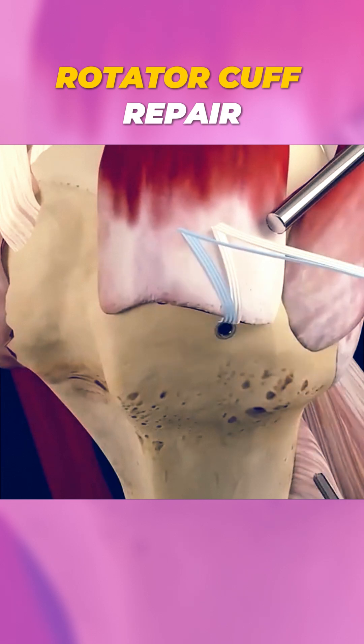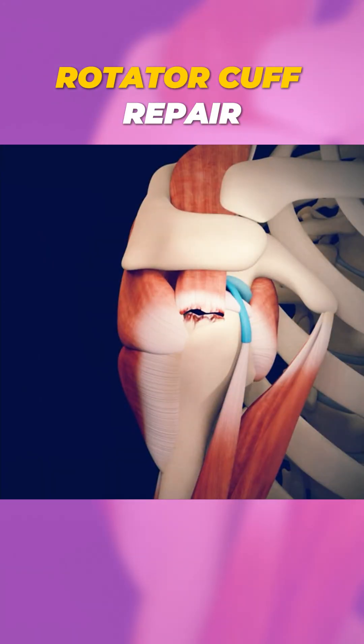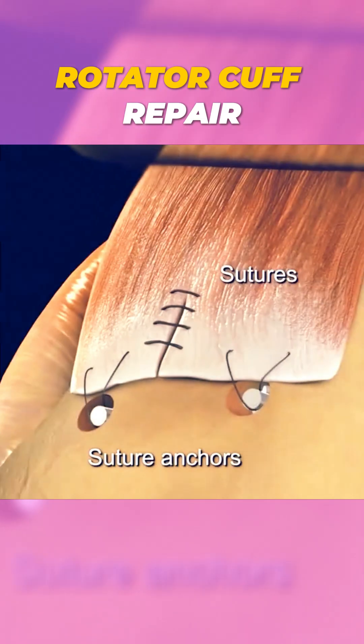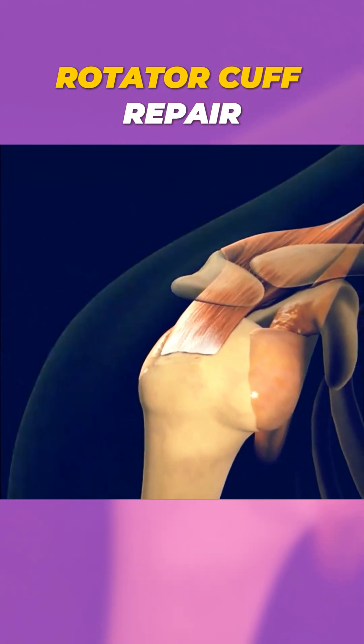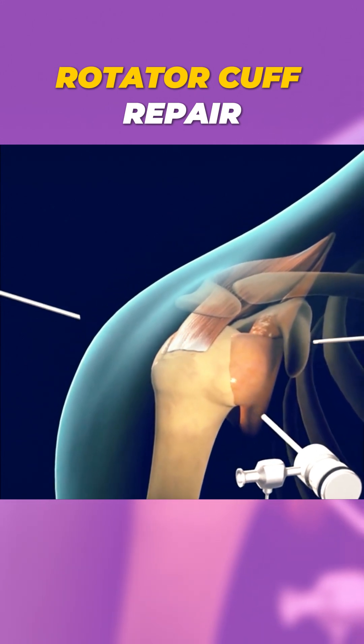These anchors secure the tendon in place while it heals. In some cases, the surgeon may need to trim damaged tissue or perform additional procedures, depending on the severity of the tear. Once everything is in place, the incision is closed with stitches, and a recovery plan, often including physical therapy, is given to help restore movement and strength.